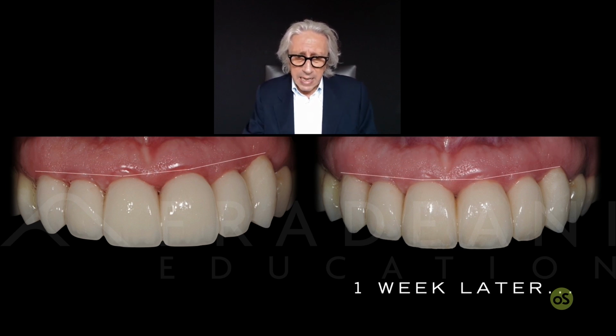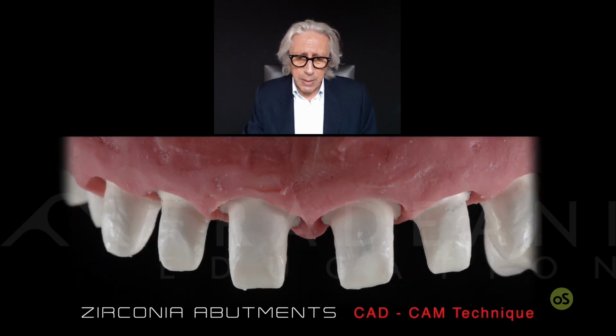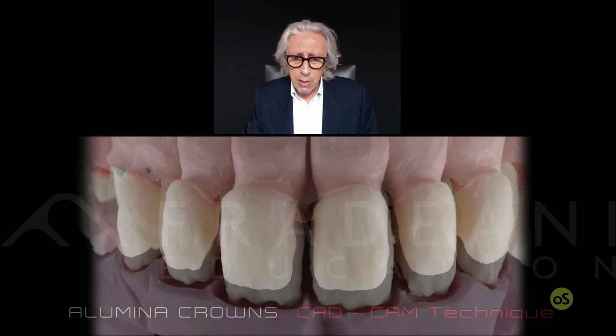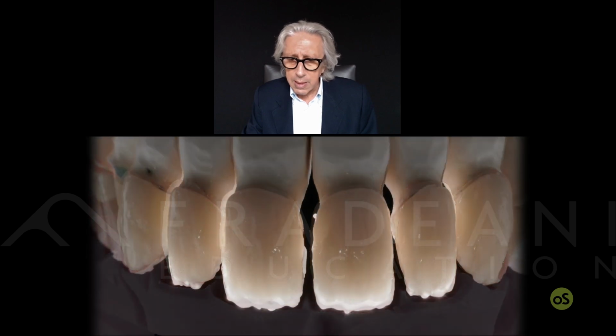Now is the time to finalize the case. We have another 20-25 days to wait for the maturation of the soft tissue before the patient leaves. And at the same time, the technician can finalize the work. He was recreating the zirconia abutments again, and over this abutment he put 6 anterior alumina crowns. We are now layering all these crowns in the proper way in order to find the best aesthetic solution. We kept the position of the incisors and the cuspid within the border of the silicone index derived from the provisionals that were tested and proved in the patient's mouth for quite some time.